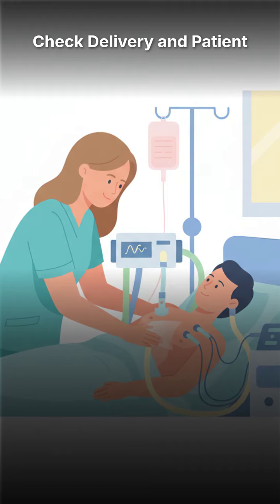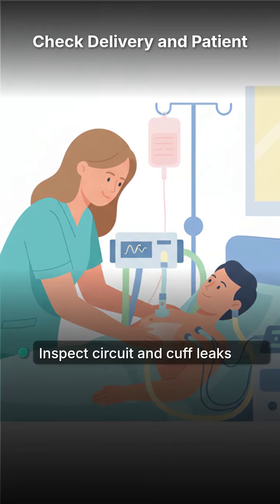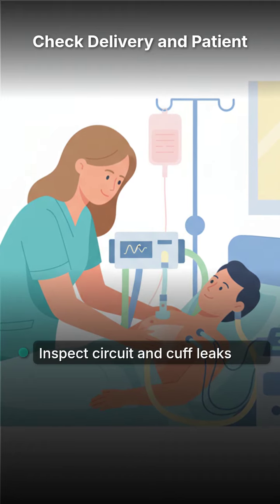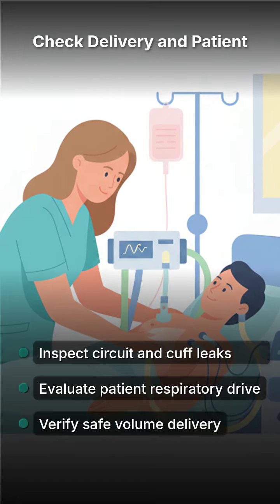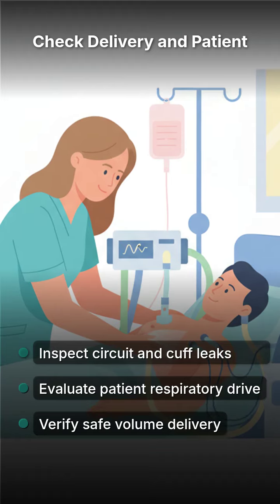To address this alarm, systematically check all circuit connections and the endotracheal tube cuff for any audible leaks. Assess the patient's respiratory drive and auscultate lung sounds to determine if they require suctioning or pharmacological intervention. Managing low tidal volume means constantly verifying both equipment integrity and patient response.